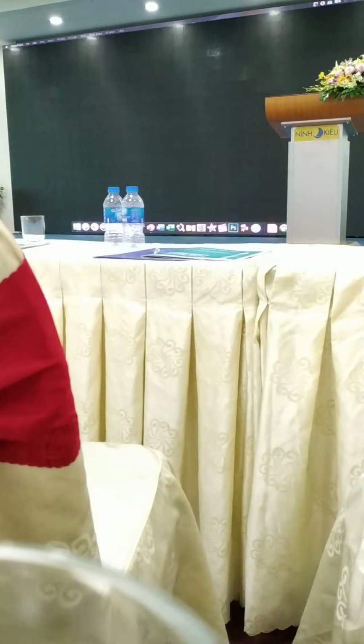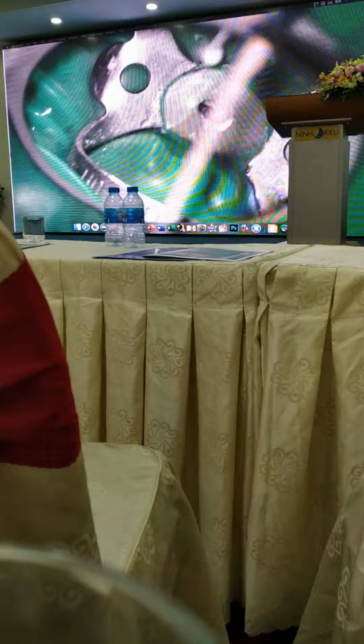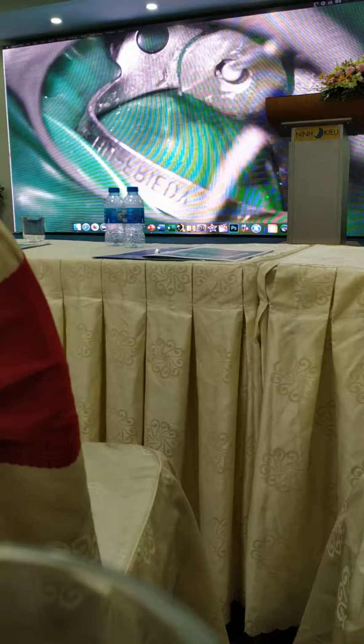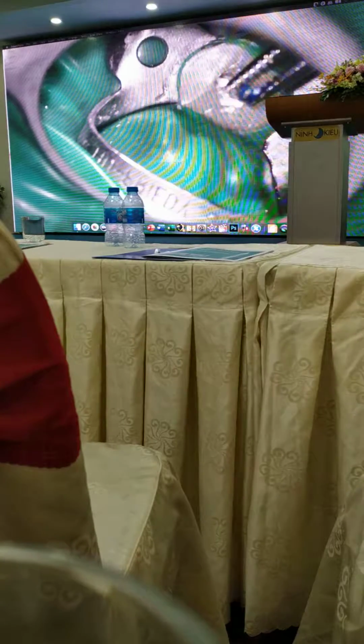And we place the gutta-percha master cone to have a pathway for retreatment, because the gutta-percha is soft. And if we need to retreat, we can go all along the gutta-percha master cone to remove the obturation material.